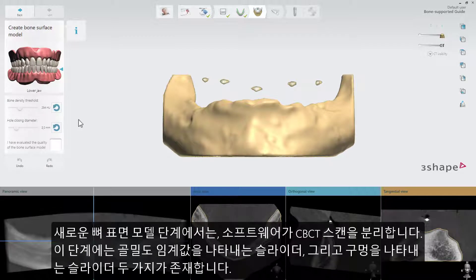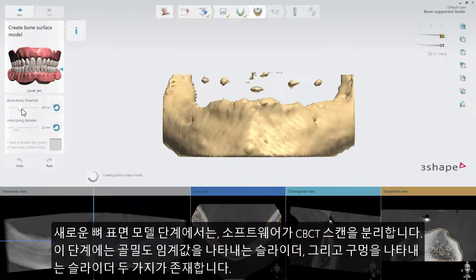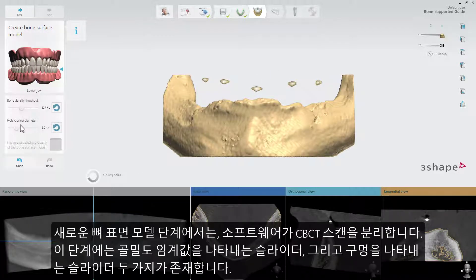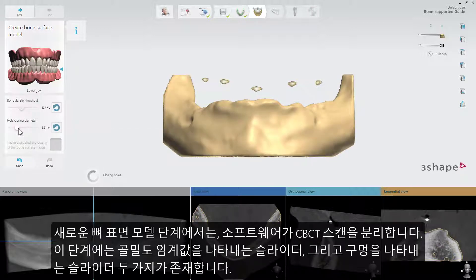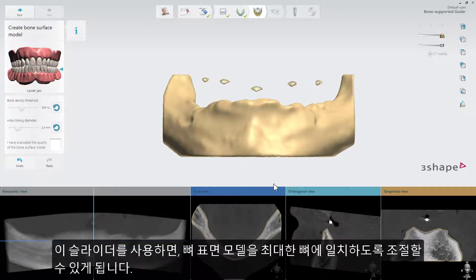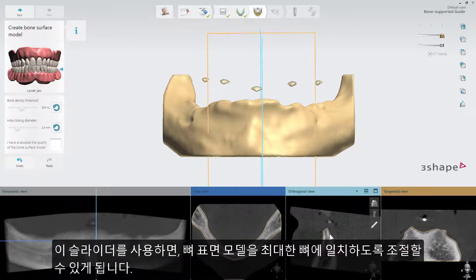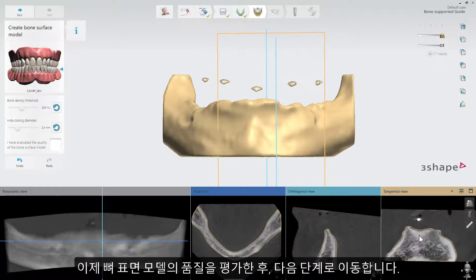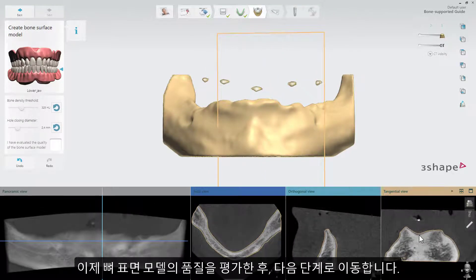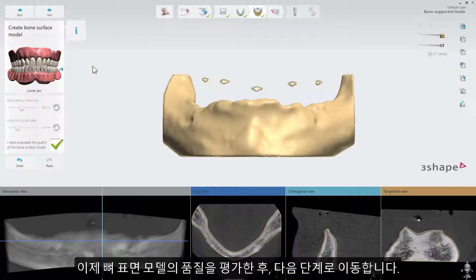In the new Bone Surface Model step, the software segments the CBCT. In this step, you will have two sliders: one for the bone density threshold and the second for hole closing. This is to help you adjust the bone surface model so it matches the bone as well as possible. Confirm that you have evaluated the quality of the bone surface model and move to the next step.